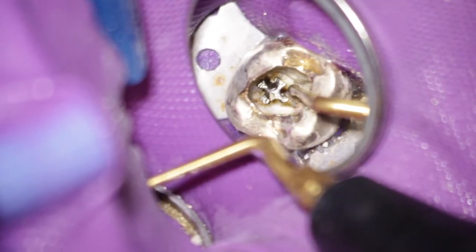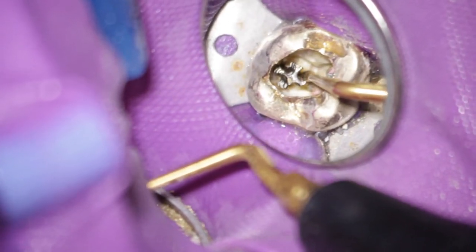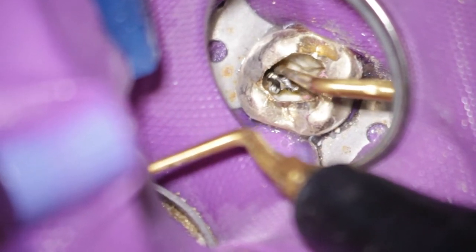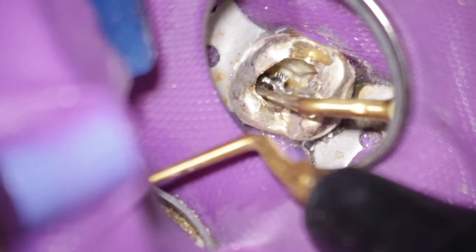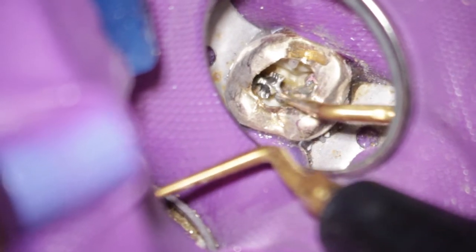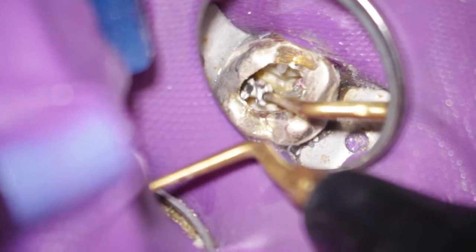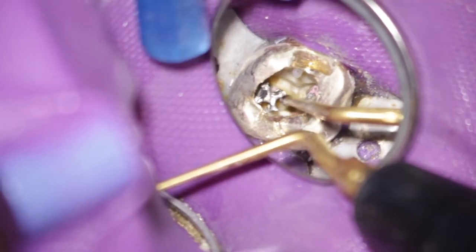It's loose and it will be turnable soon. Now you can see the movement, and it turns and turns around. Now the work is done. All we have to do is to take it out and start the retreatment.